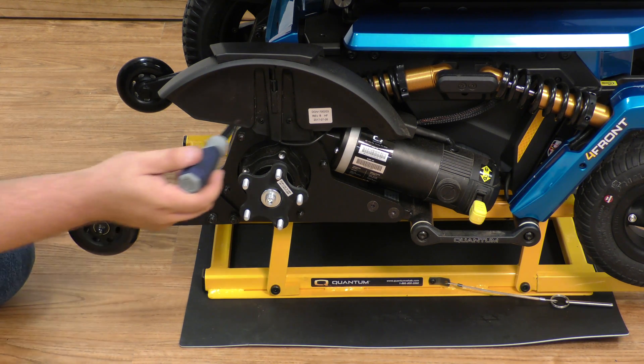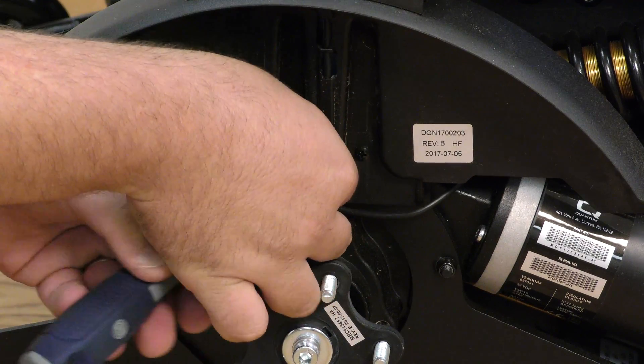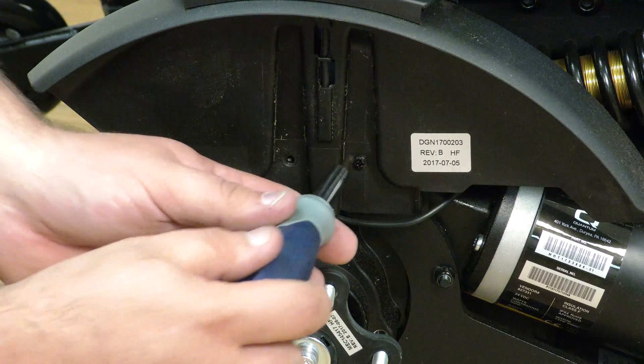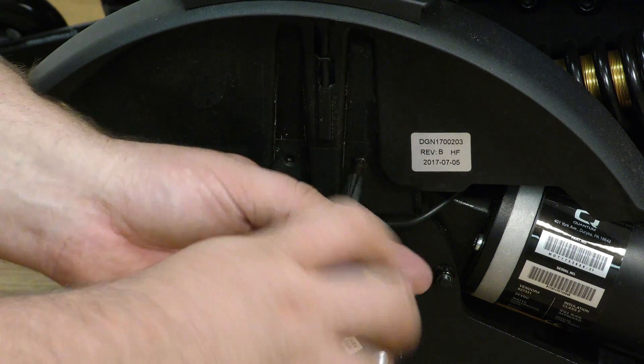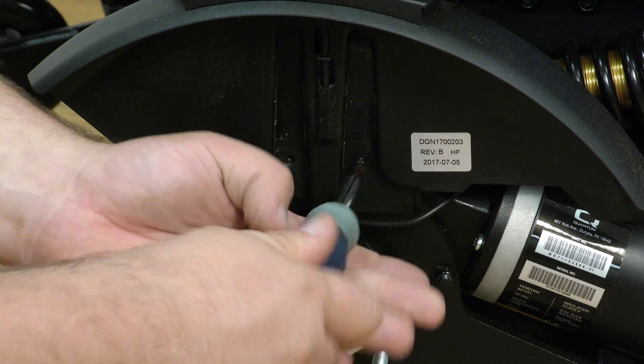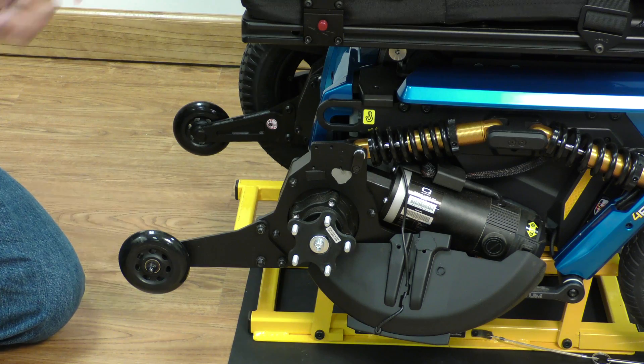With a Phillips head screwdriver we need to remove the fender. Once the fender is removed, then we can see the components underneath.